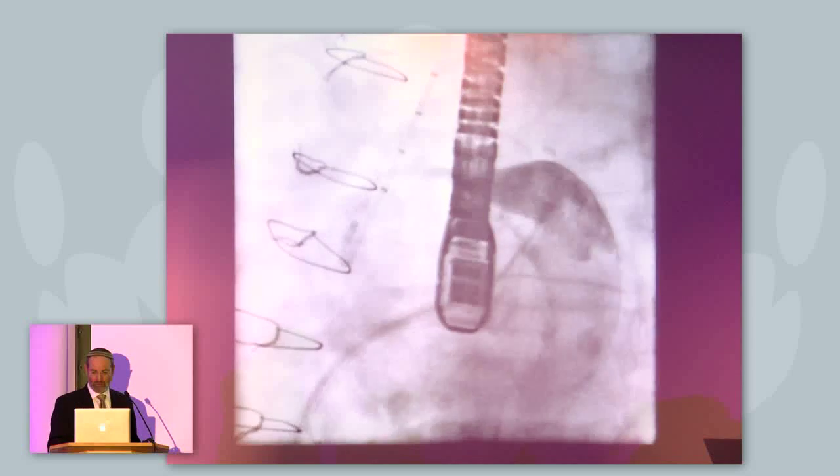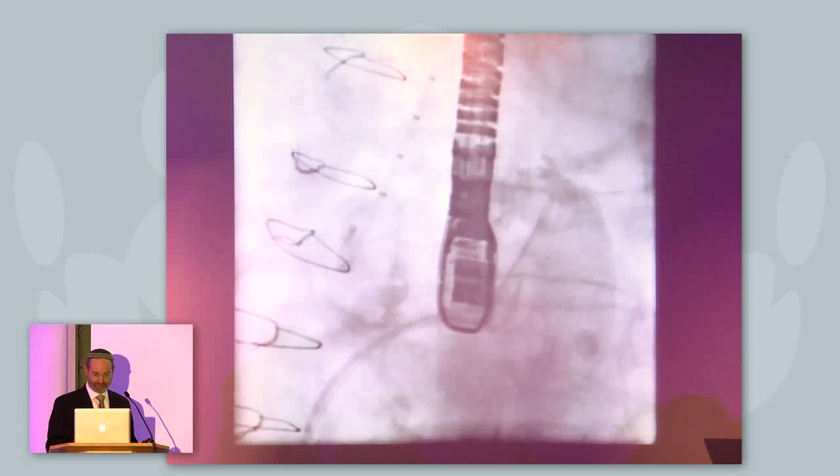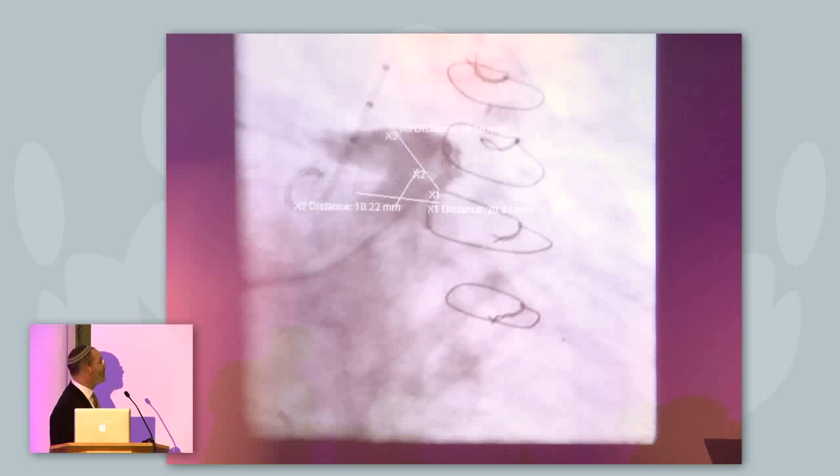So at this point, we progressed and did measures, and this is what was going through my head. Where the heck do I measure this thing? Is this right? Is this right? Is this right? Which size of device do I tackle, and how do I go ahead against it?